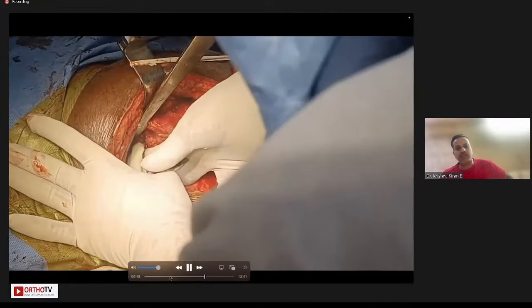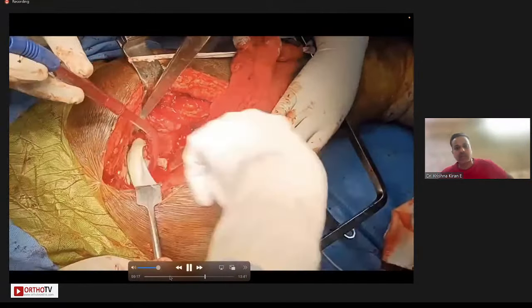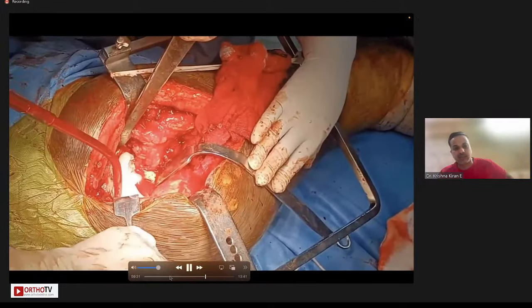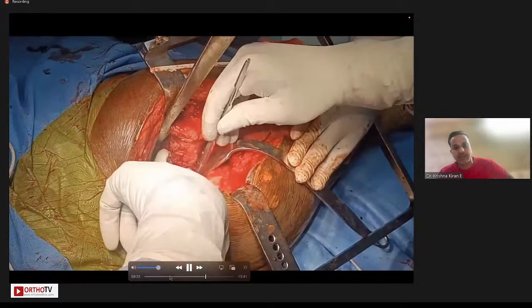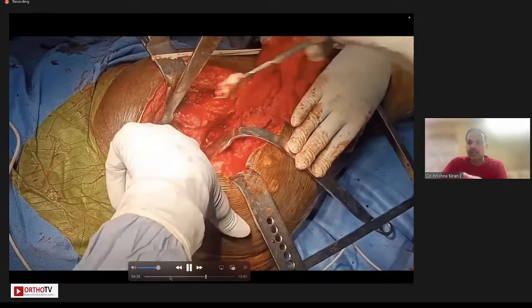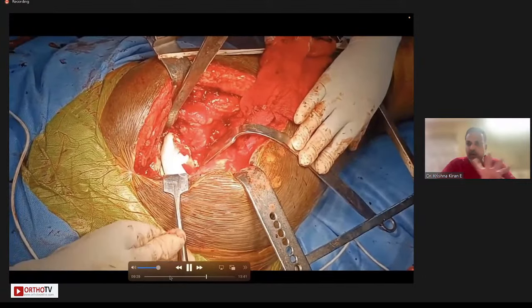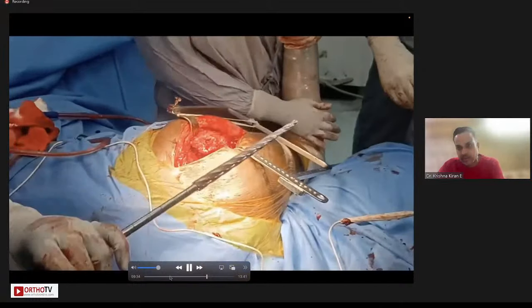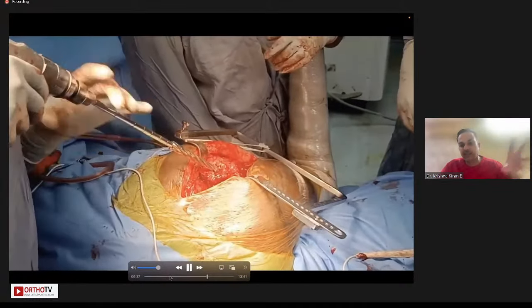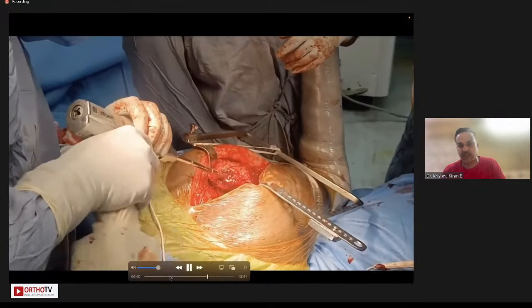And the cup you always position trying to optimize the amount of host bone contact. So already the host bone contact is around 30-40% in this case. So you don't look at where the inclination and version is on the socket. So we are employing what is called a hybrid philosophy. We are using the augment for host bone contact. We are using the cup for residual host bone contact. And then we are using the cement for superior unitization and a cemented liner to correct the inclination and version.